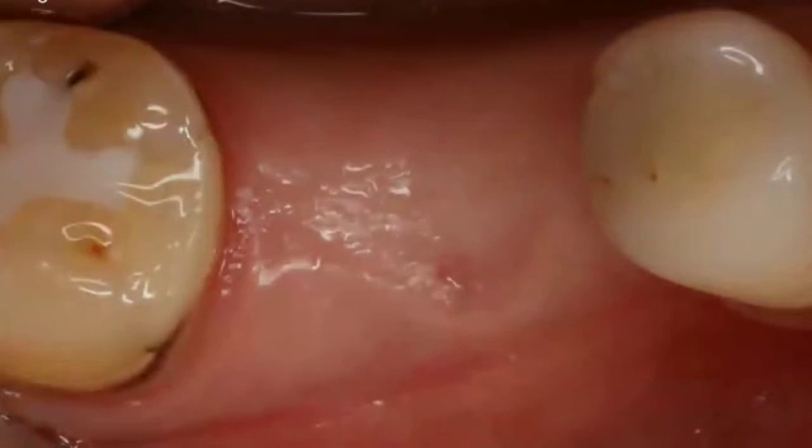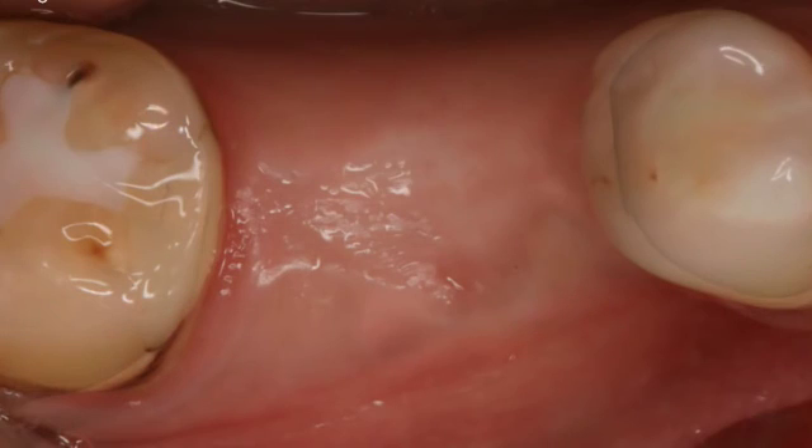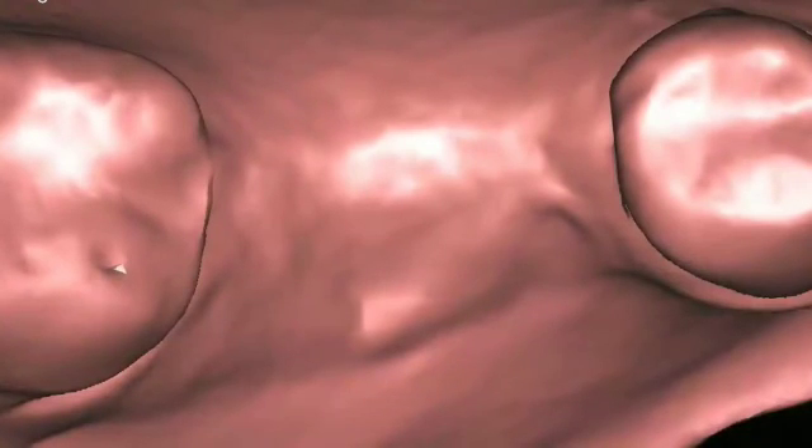Three months later, you can see that healing occurred. Even without primary closure at the time of extraction, we achieved really nice healing with good attached keratinous tissue — that's the reason we don't close the flap primarily. This patient is a candidate for an implant, so we need to assess the bone in three dimensions. I'll take an impression, digitize it, and import it into my computer-guided software.